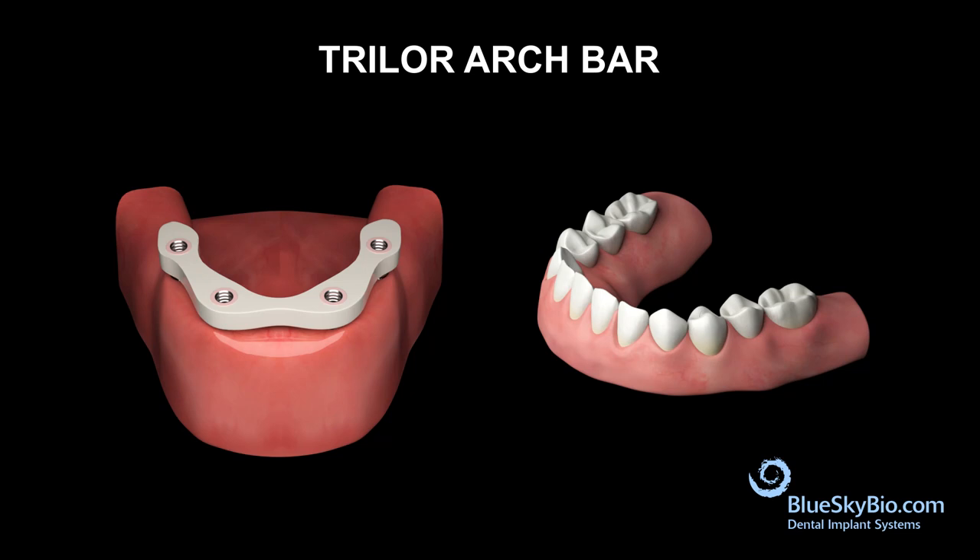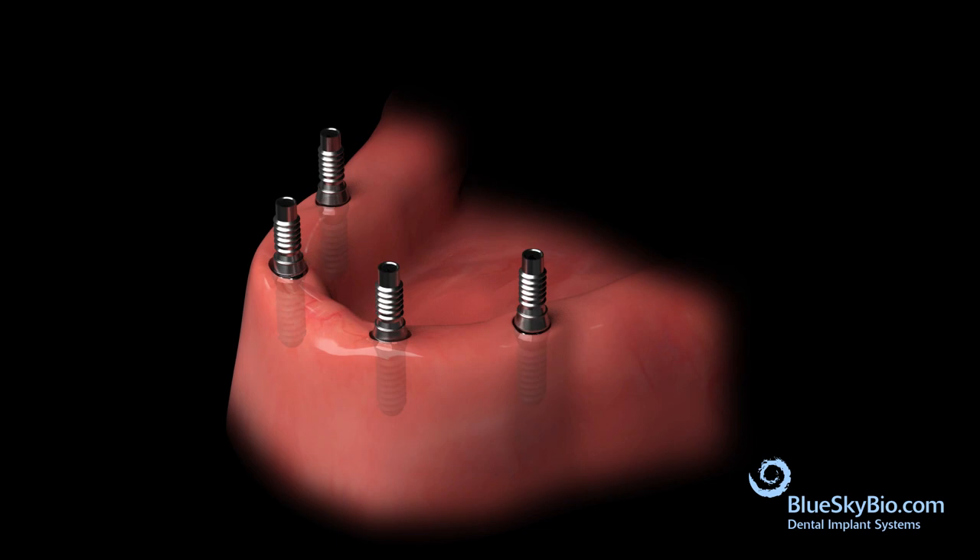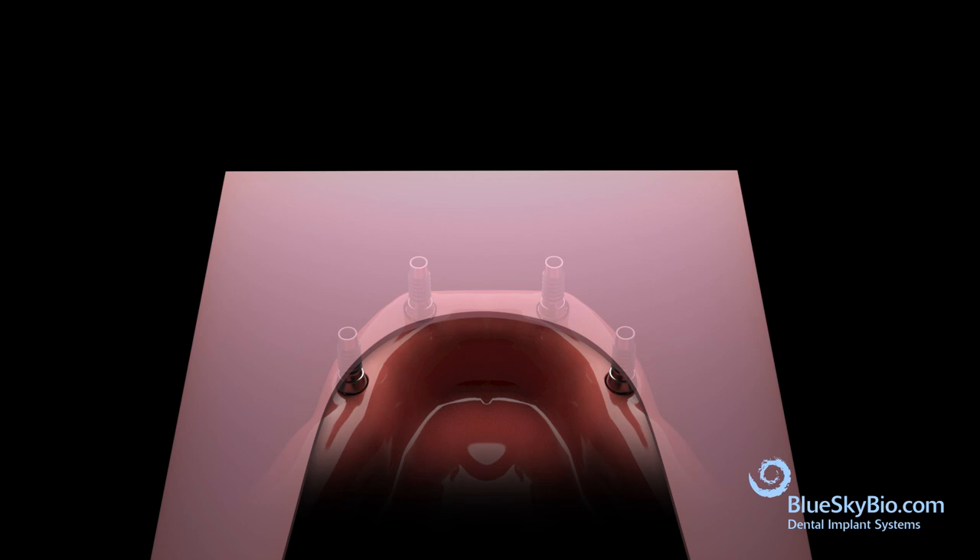The Trilor arch bar technique is a very adequate and affordable way to make a temporary prosthesis. Here is the patient's lower mandibular arch with four implants and multi-unit cylinders. Take a piece of pink wax and index the positions of the multi-unit cylinders.